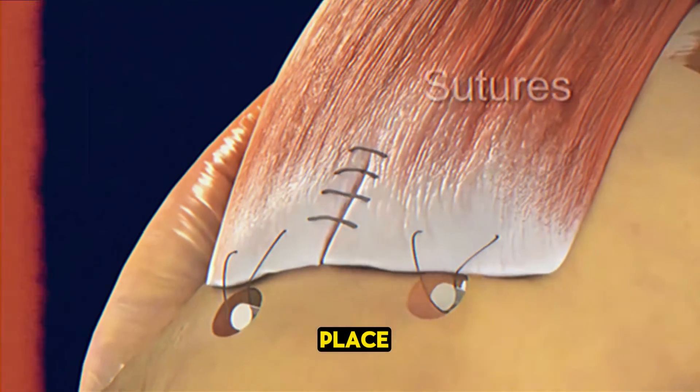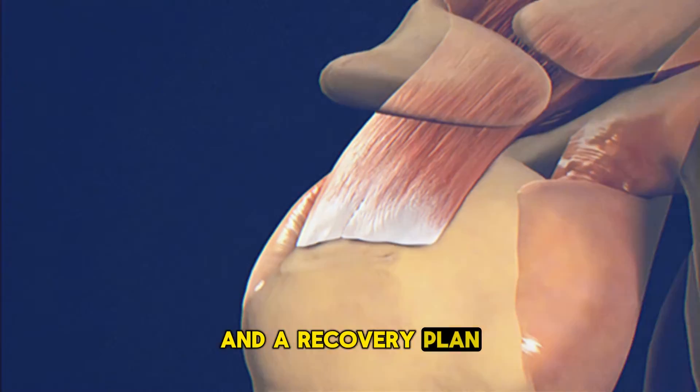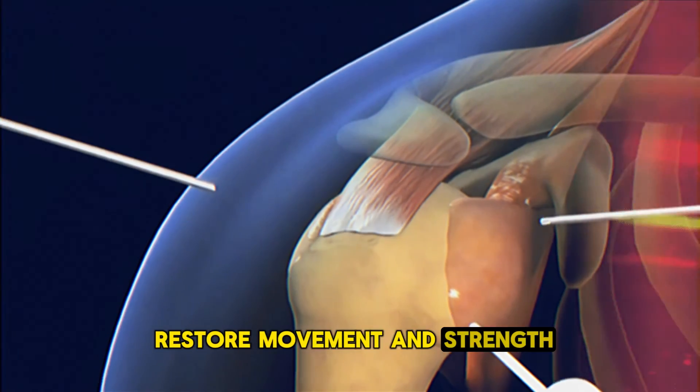Once everything is in place, the incision is closed with stitches and a recovery plan, often including physical therapy, is given to help restore movement and strength.